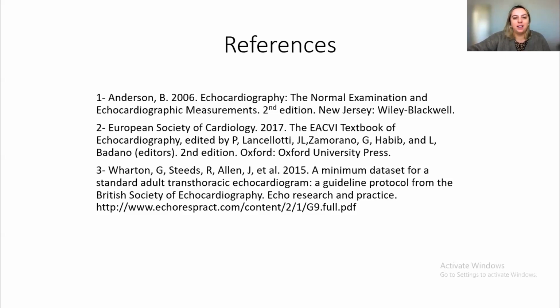There you go. What is the name of this cardiac echo view? You should see the picture, and there are again 4 answers for you. Okay, I see people are participating. About 60% who are present are answering, so I'll give another 10 seconds.